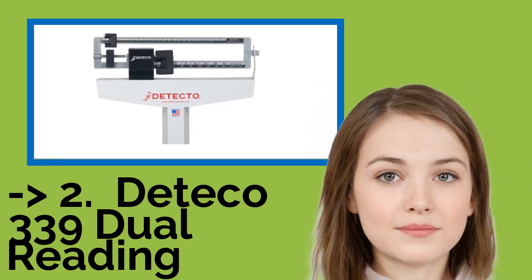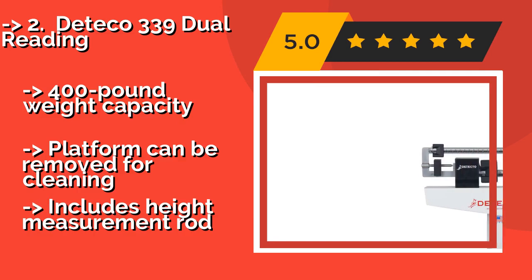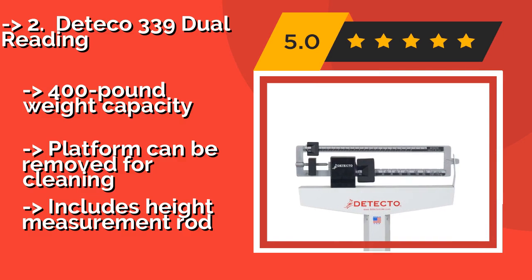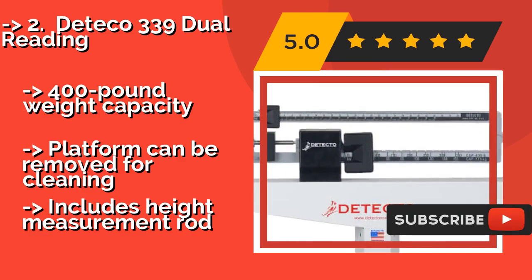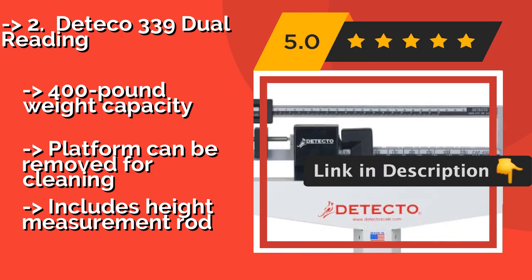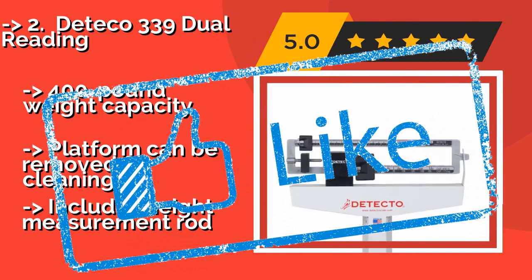The Deteko 339 Dual Reading, around $187, is a great value option, priced right for the clinic or medical practice on a budget or one that needs multiple scales. Readings are displayed on both the front and back, allowing for a range of placement positions. It has a 400-pound weight capacity, the platform can be removed for cleaning, and it includes a height measurement rod.